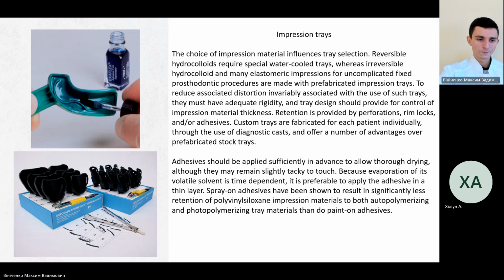Impression tray. The choice of impression material influences tray selection. Reversible hydrocolloids require special water-cooled trays, whereas irreversible hydrocolloid and elastomeric impressions for uncomplicated fixed prosthodontic procedures are made with prefabricated impression trays.